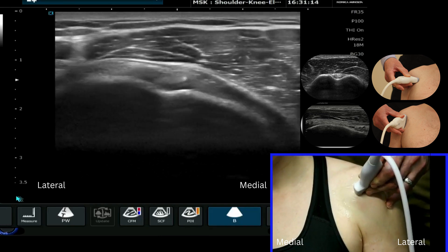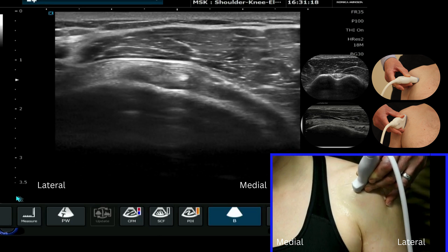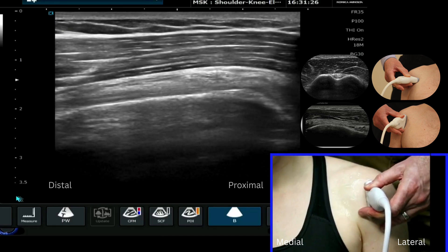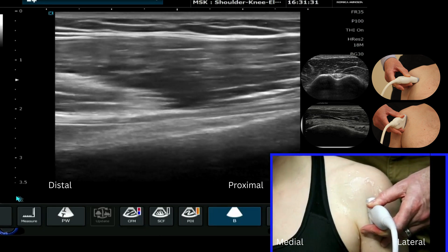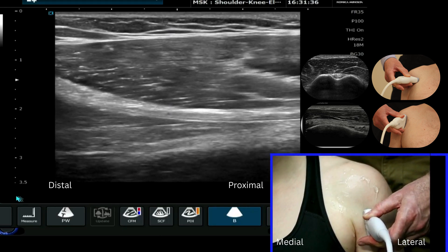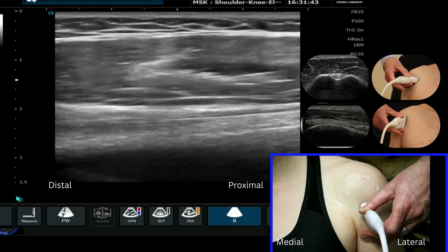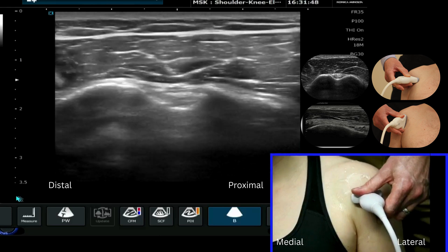I can look at the long head of biceps tendon also in the longitudinal plane by rotating my probe by 90 degrees, so I'm then looking at a long plane view of the long head of biceps, and I'm just going to follow it down until we get to the musculotendinous junction here. We can see the most proximal fibres of the long head of biceps and the biceps musculotendinous junction. This is how we scan the long head of biceps tendon in the bicipital groove.